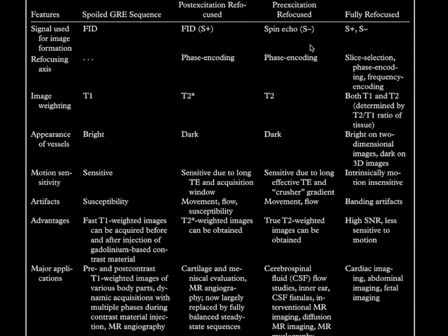most of the time what we use them for is since you're acquiring data about every 50 milliseconds, you can get very rapid imaging. It's typically or often used in a 3D technique. Since you're acquiring data rapidly, you have time to do phase encodings in two different directions so that you can do 3D imaging. And most of these tend to be very sensitive for fluid.